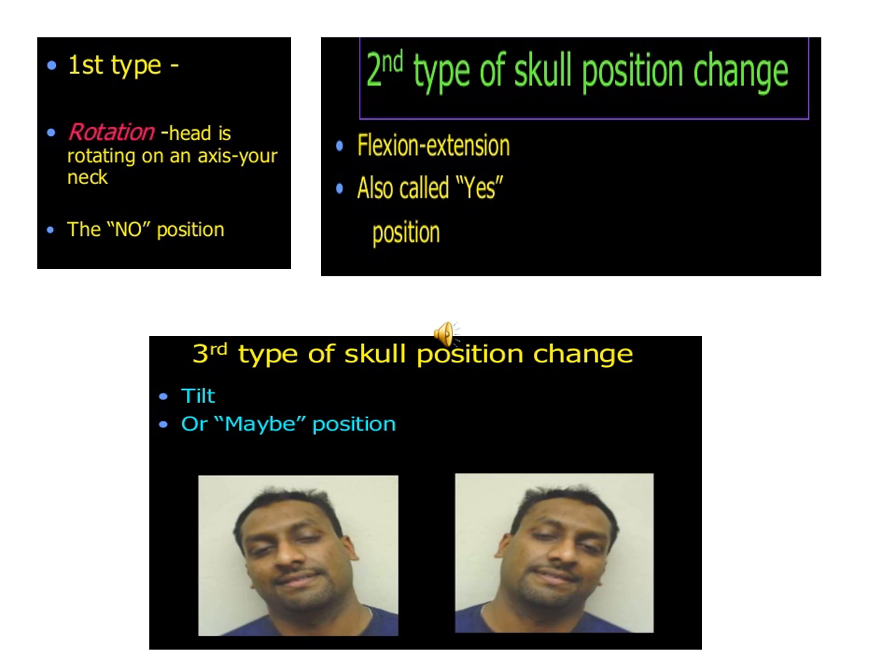Rotation is also known as the no position. Flexion or extension is also called the yes position. Tilt may also be called the maybe position.